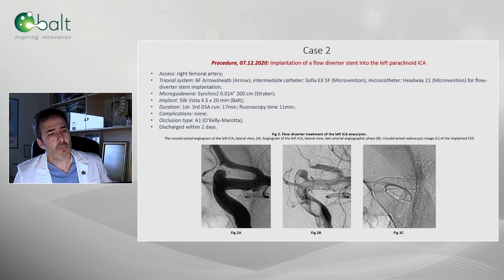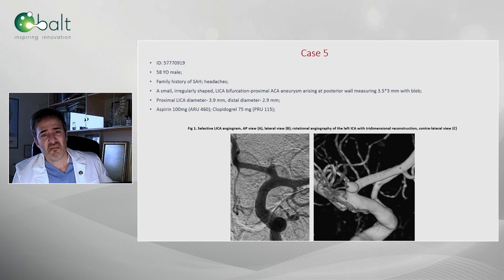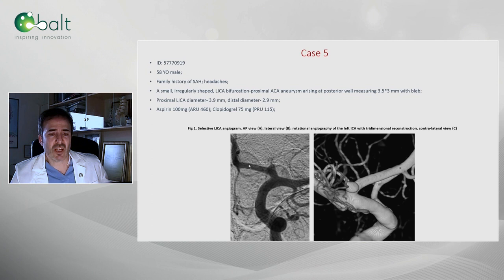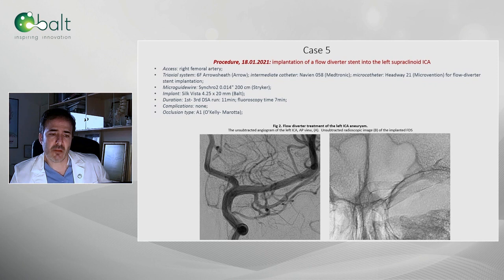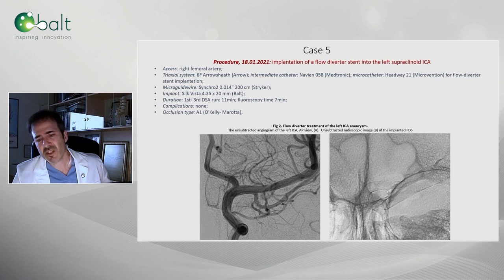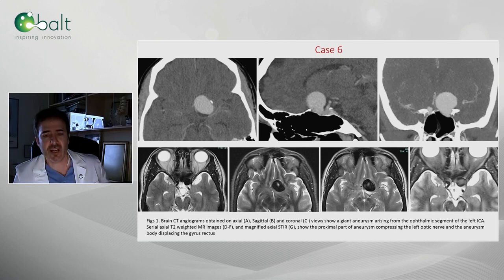Look at the time that it takes to implant the device and to perform the intervention. Case 5: a proximal posterior wall anterior cerebral artery dissecting aneurysm. In this particular case, instead of crossing or covering the anterior cerebral artery, I did something a little bit different — crossing from MCA to carotid, understanding that I have competitive flow from the other side with a good ACOM. This is the image of the MCA-to-carotid flow diverter stent. Nice radiopacity.